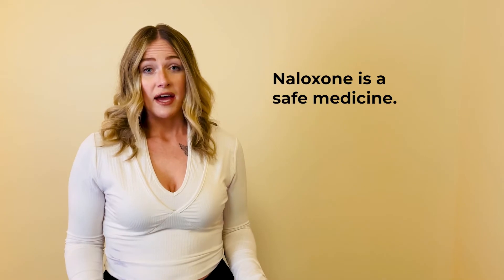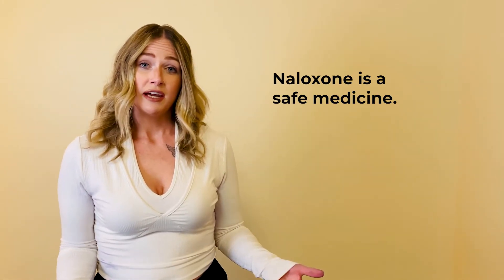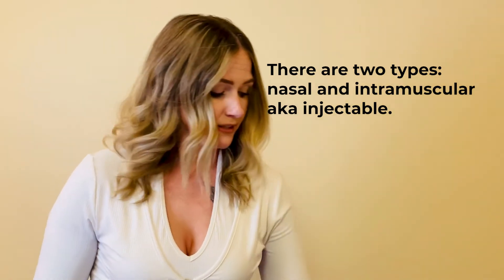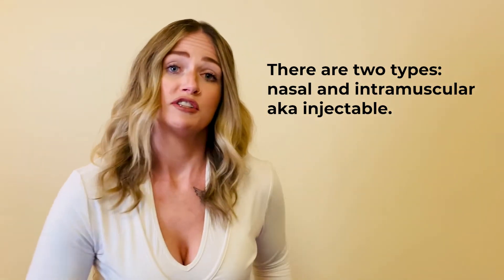It's important to note that even if a person is not overdosing, administering Narcan will not harm that individual. There are two different kinds of Narcan. One is a nasal that gets absorbed through the sinus passageways. The other is intramuscular, which gets injected into the large muscle.